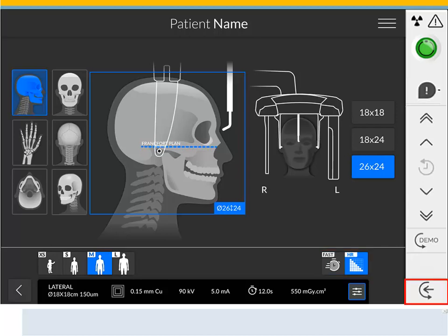Patient Entry positions the unit in the patient entry mode. Demo enables the demonstration mode of the acquisition procedures to a patient without the X-ray.